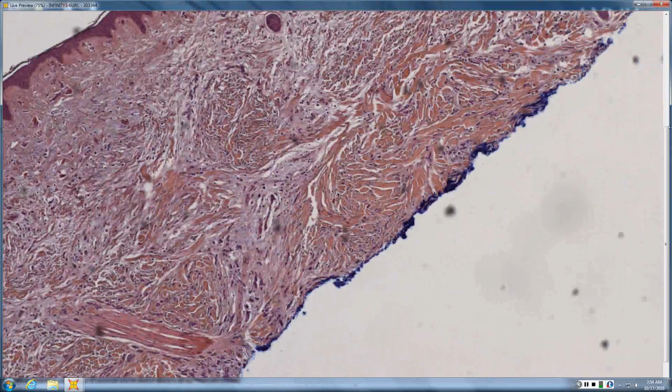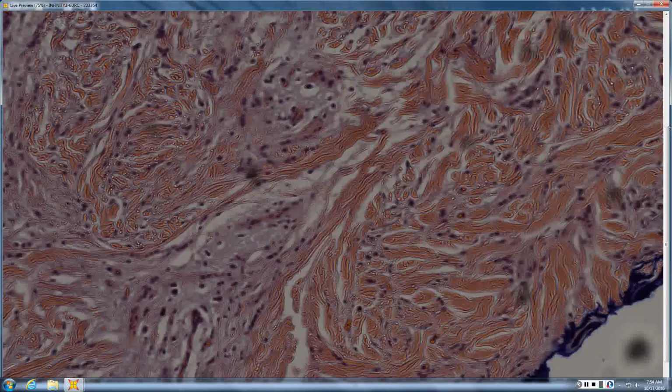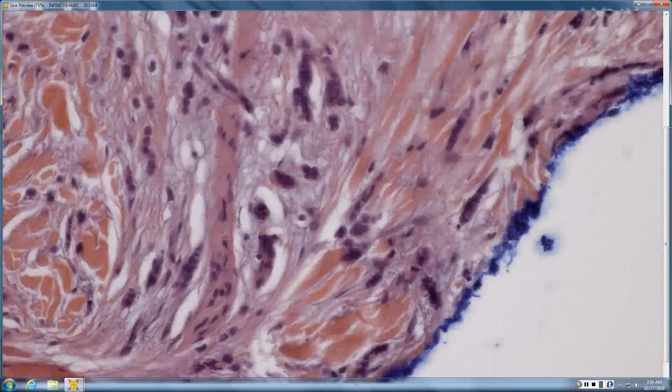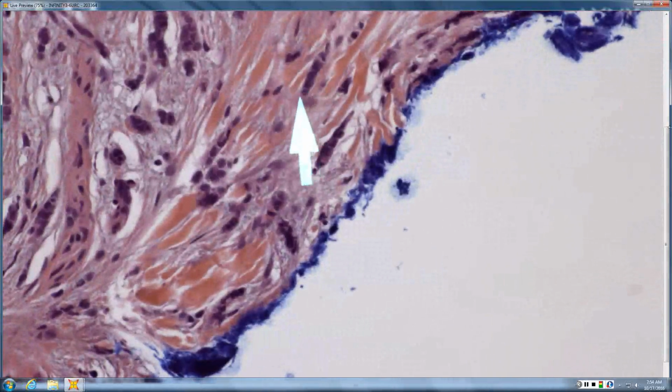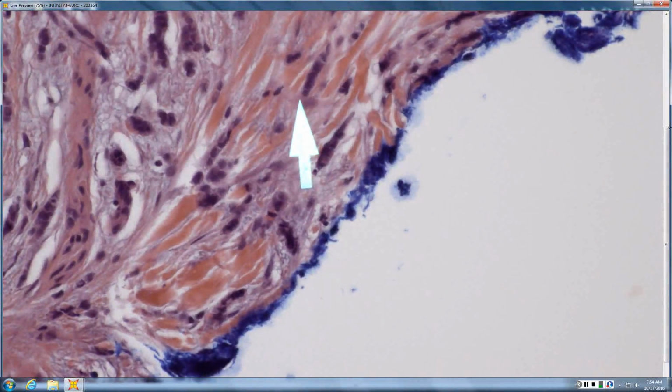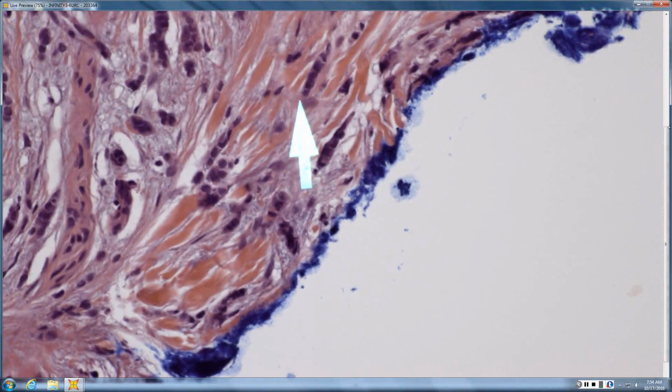I see a busy dermis, a little bluish. A busy dermis. It has an interstitial GA pattern, except for the neoplastic cells. Lining up in a single file array with nuclear molding and hyperchromasia. So this is metastatic breast.